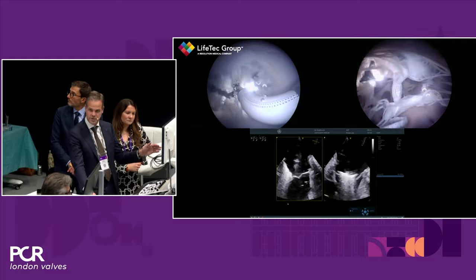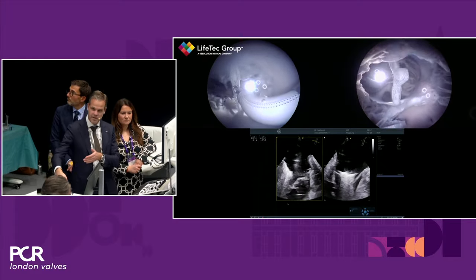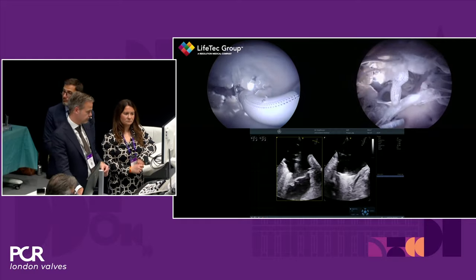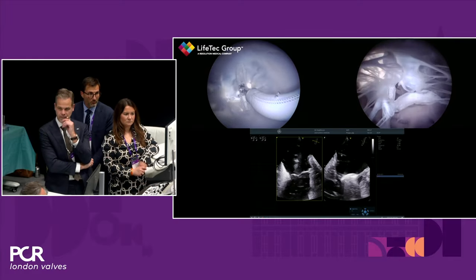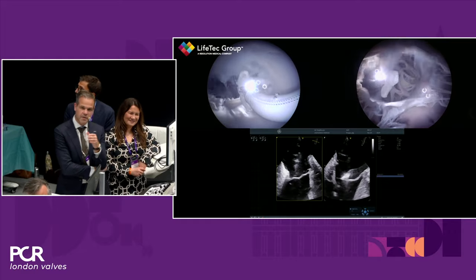So normally what you would say is that you would advance and use a little bit more of M-knob to dive straight in towards the apex. So, but again, very important here is the fact that prior to attempting grasping, we need to be sure that we are, you know, moving straight. Otherwise, it's like driving the car when you're drunk. All right. Especially with the bigger clip.